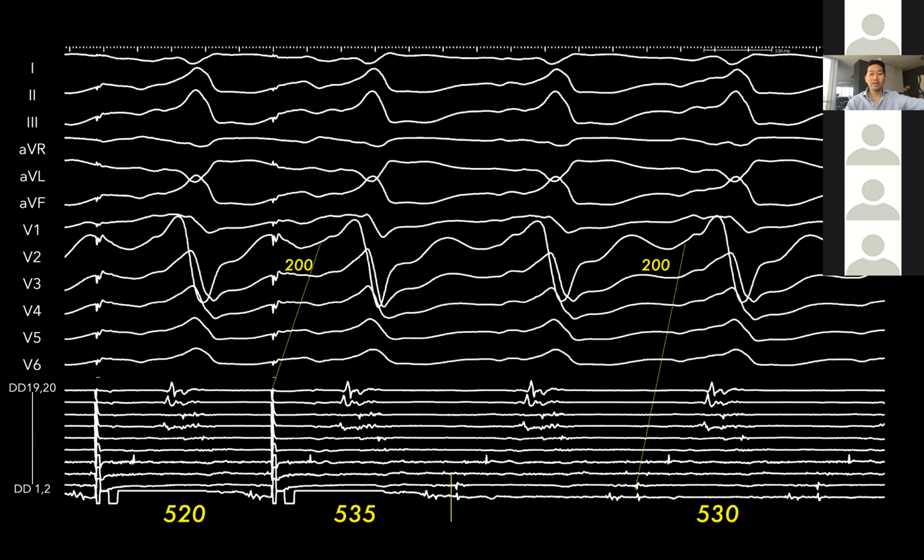And then this again is just to show you that there's beauty within the intracardiacs when you're looking at the multi-electrode. Here is concealed entrainment with intracardiac concealed fusion: the shape of the way that this duodec is being activated, this V shape, is preserved during pacing as well as during the circuit, during the tachycardia. So here is a really nice example of intracardiac fusion with every criteria. You could call that the fourth criteria, but we don't require that.